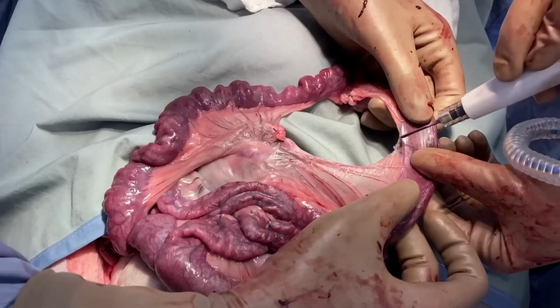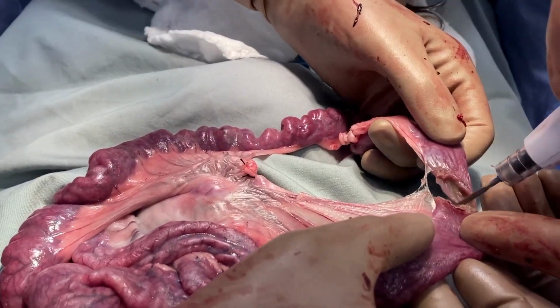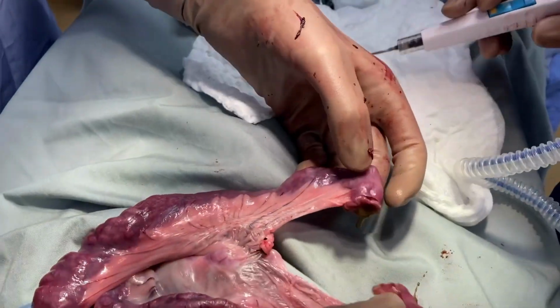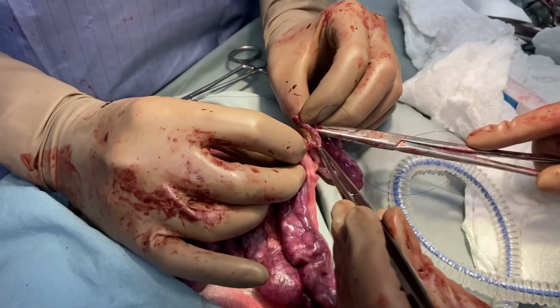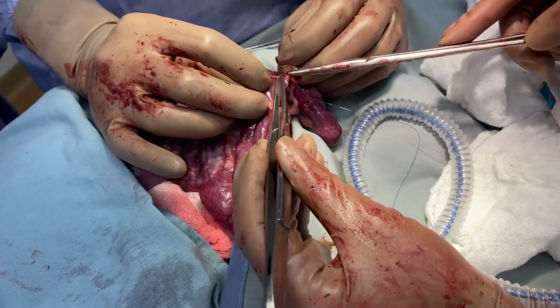Next, transect the bowel using the cautery. This should be done obliquely, again to maintain blood supply to the anti-mesenteric edge. Next is the anastomosis. Here we are using the hand-sewn end-to-end technique.